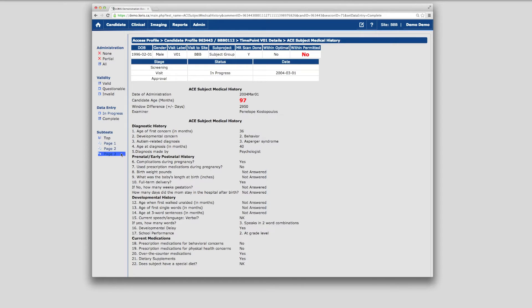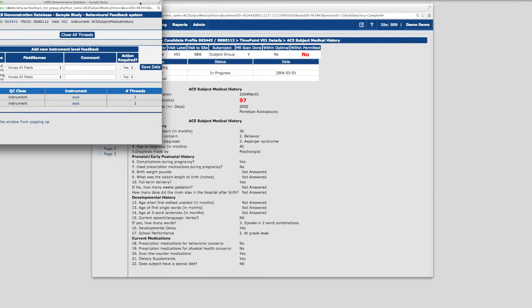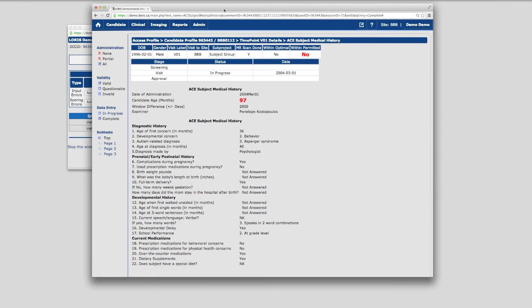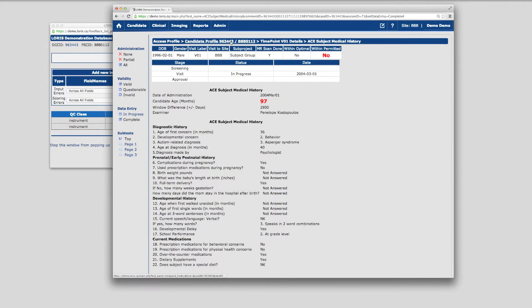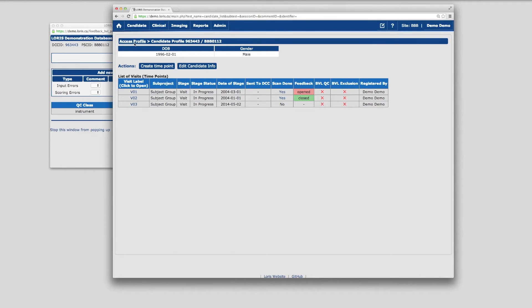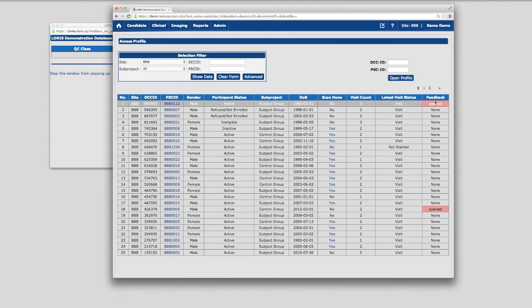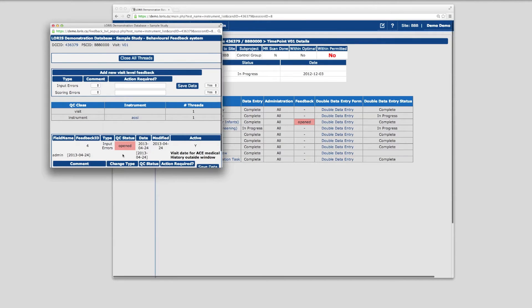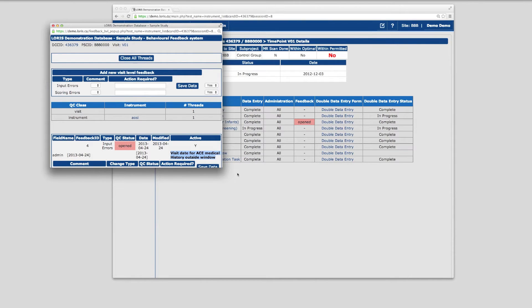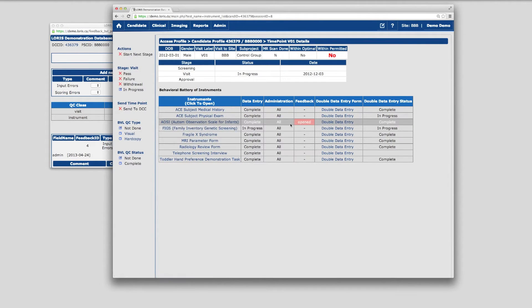Longer instruments may split data entry up over several pages. One important tool on the behavioral database side is the Behavioral Feedback Module. Click on the pencil icon in the menu bar and it will appear as a pop-up so that feedback can be viewed in parallel with any page in the database. Here users can view and enter feedback comments or flag errors of various types, such as scoring errors in a specific instrument or larger data quality issues across a candidate's time point data set. As you navigate between pages, the Feedback Module will dynamically display all feedback items relevant to the page you are looking at.